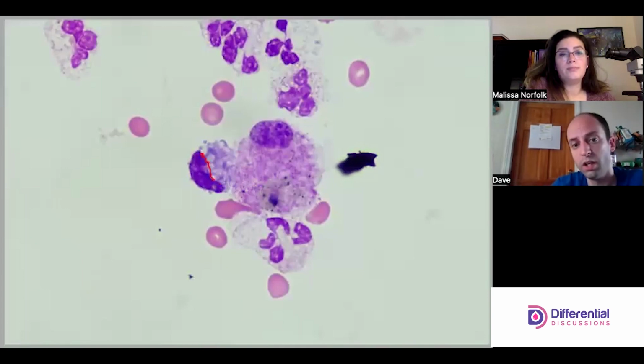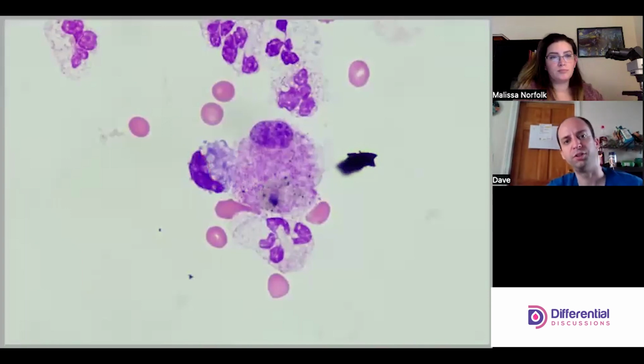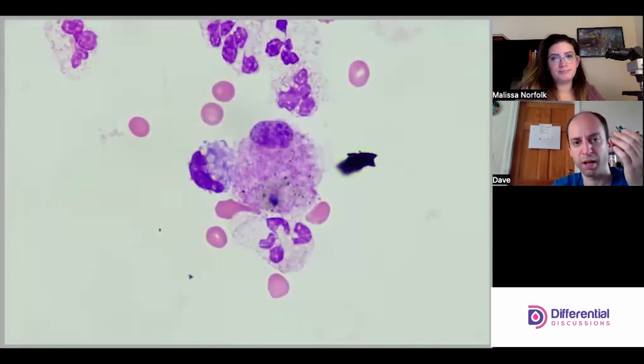The nuclear contour actually looks normal. If I had to critique, the darkness of the nucleus is a little bit on the dark side, but I'm trying to be sensitive to how condensed it is too. This looks like it's probably a monocyte, and it looks a little bit squished, so the colors are going to get a little bit darker.